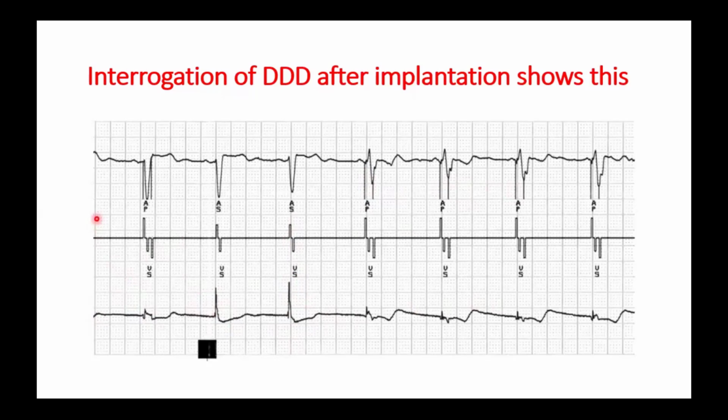Or what's the differential diagnosis for such a thing when you see this? Please answer in the chat room. Dr. Iman, you were answering very well. Dr. Didier, Dr. Amr Gamal.